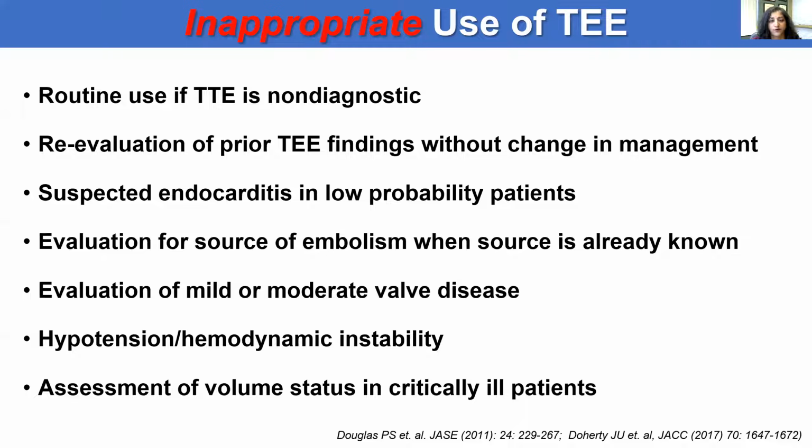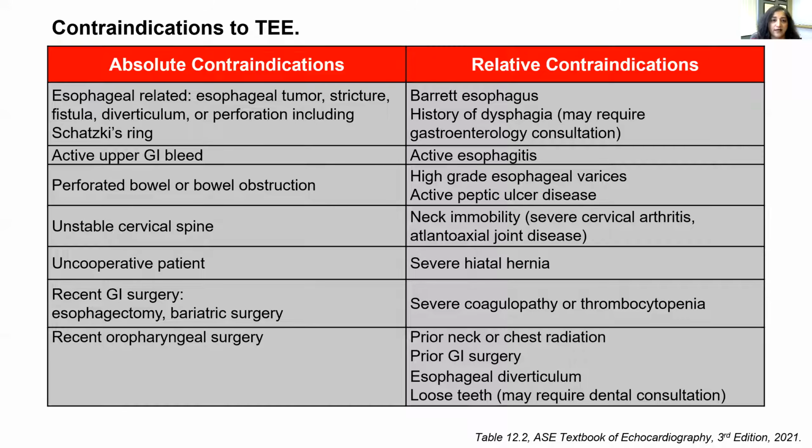Equally as important as appropriate use of TEE is inappropriate use of TEE. TEE is not indicated if the TTE is non-diagnostic and the findings would not change management. It's not indicated in low probability endocarditis patients, and it is not indicated for the assessment of volume status in critically ill patients.